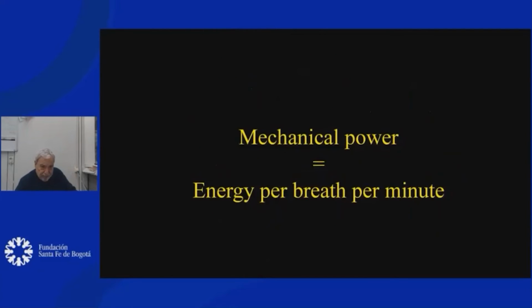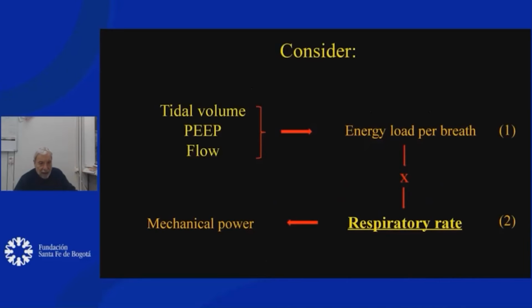So, mechanical power is the energy per breath per minute. We examined so far which are the components of energy in each tidal volume. But here we have another thing, respiratory rate. And the curious thing is that the respiratory rate is usually neglected.